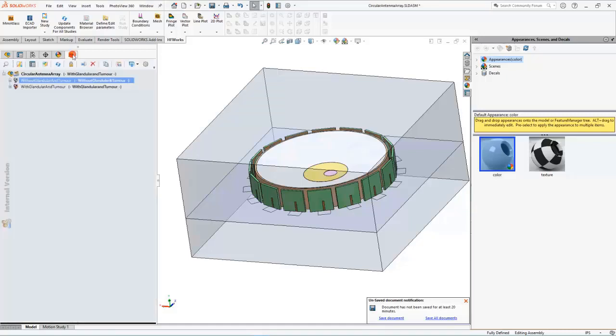And now we're gonna use HFWorks to study the effect of tumor on results. As you can see here, I have two studies. Each one belongs to a configuration. The first one belongs to the configuration without glandular and tumor, and the other one belongs to the other configuration with glandular and tumor.